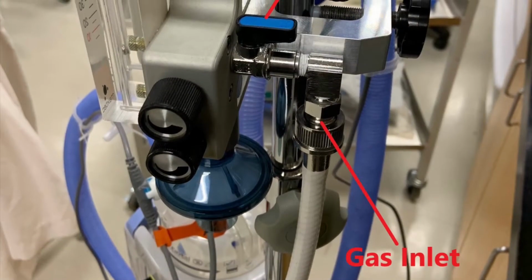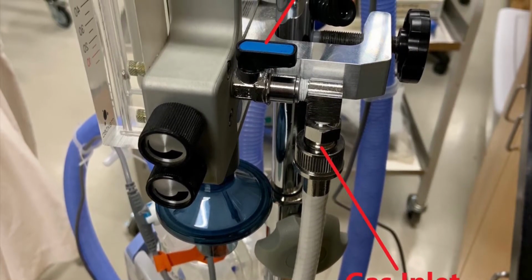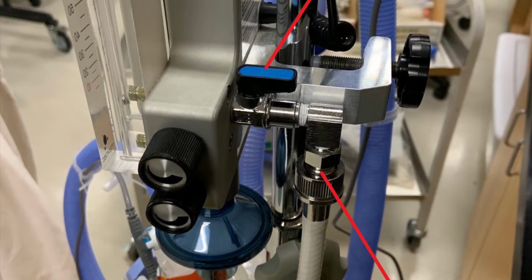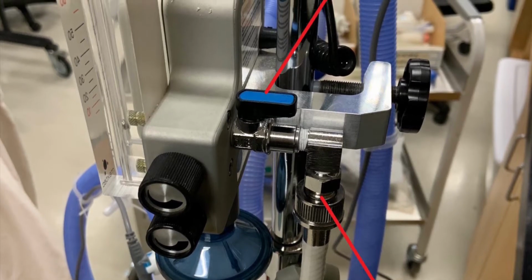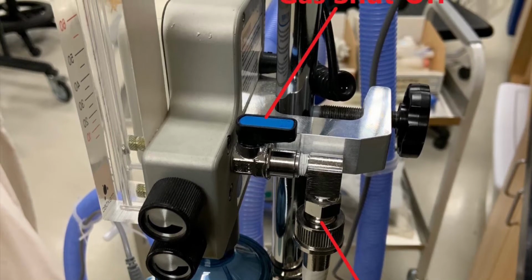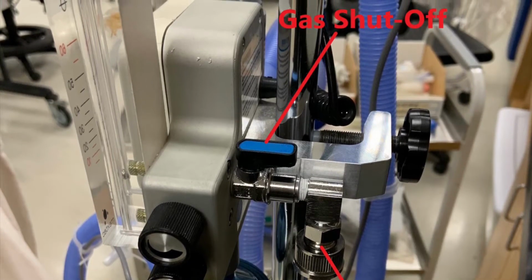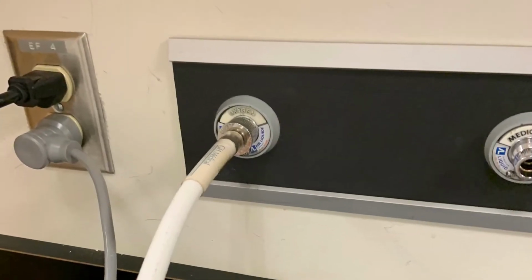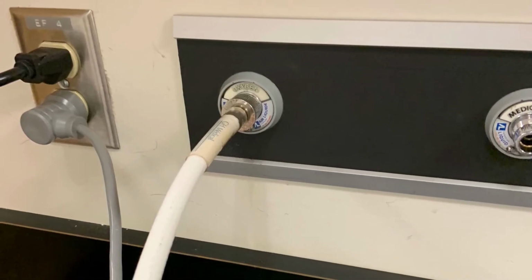Directly behind the flow meter is the gas inlet. This is where high pressure oxygen tubing is connected from your wall outlet. You must also open the gas shutoff valve that is located above that in order for gas to flow from the inlet into the flow meter and blender. Connect the high pressure oxygen hose to the blender first and then connect to the wall.